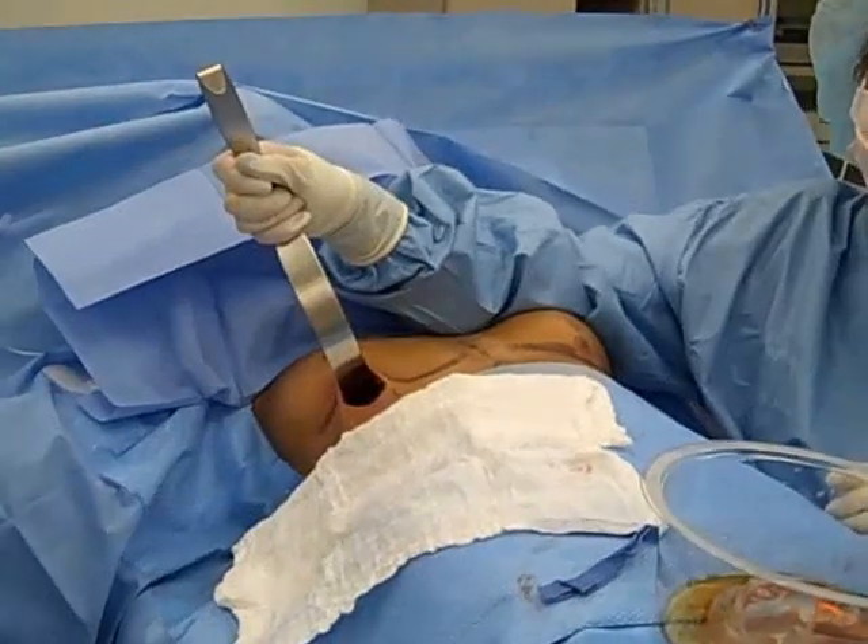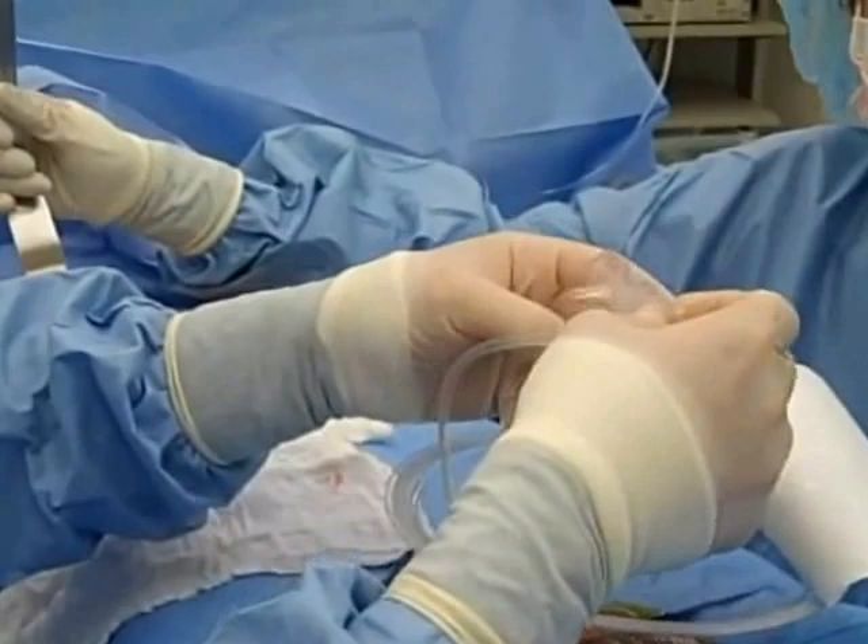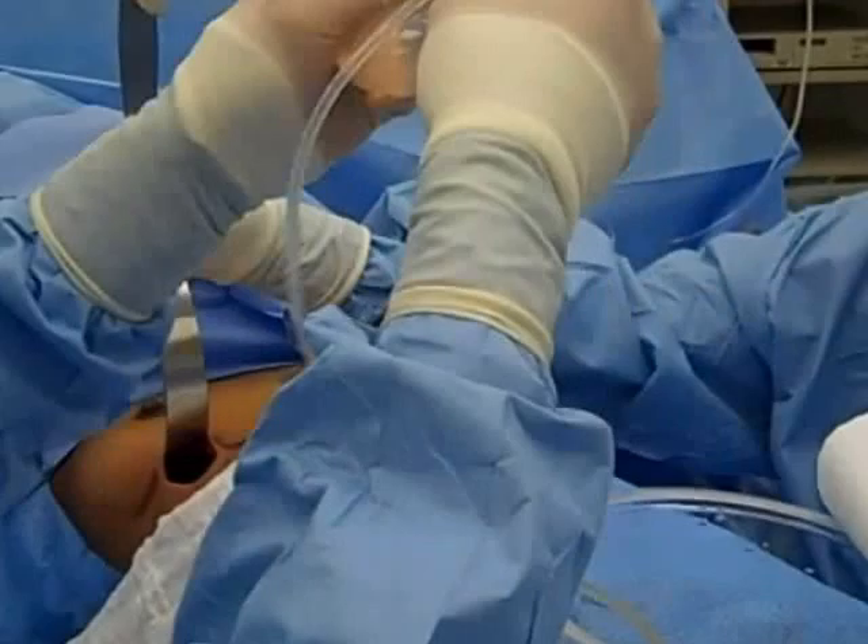This is a saline implant. You can see the fill hose here to fill it up. There's already something in it that I've already put in to get all the air out of it. Saline implants go in a little bit smaller — they're placed and then filled up.